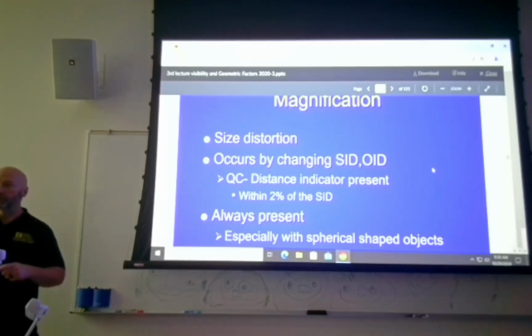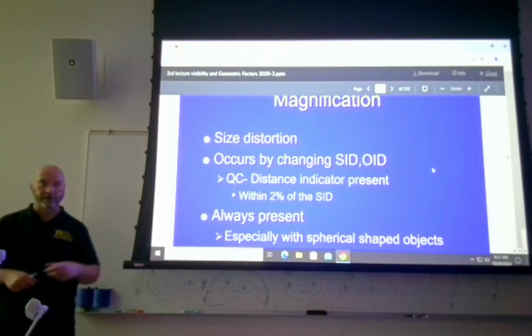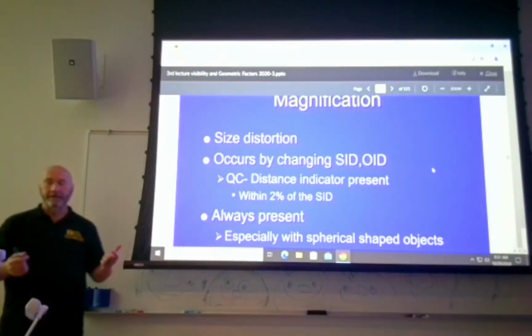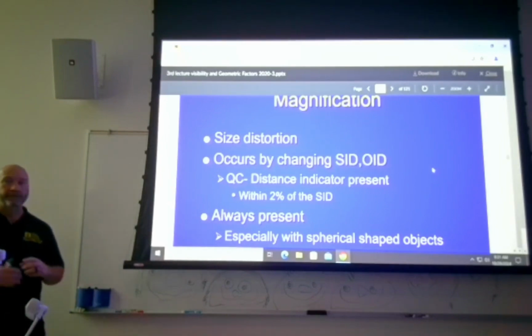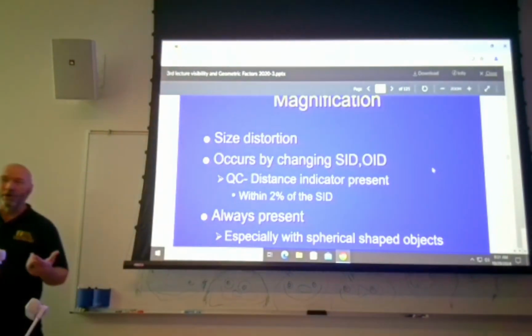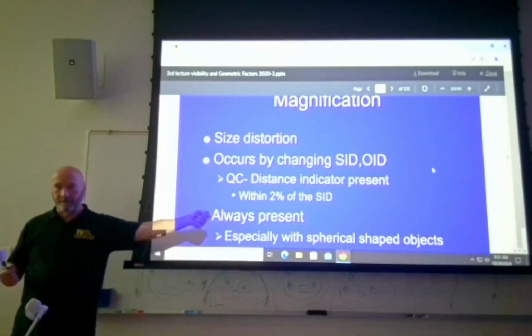Especially on your portables, it may just be a tape measure. Right? It sticks off the bottom, and you pull the tape measure out and measure how far out you are. Those used to be standard on pretty much all X-ray tubes. Most of your X-ray tubes now, I think, are going with a digital display or marks on the ceiling or something that indicates exactly what your SID is. Just so you know, on your portables, you pull that thing out and you measure.